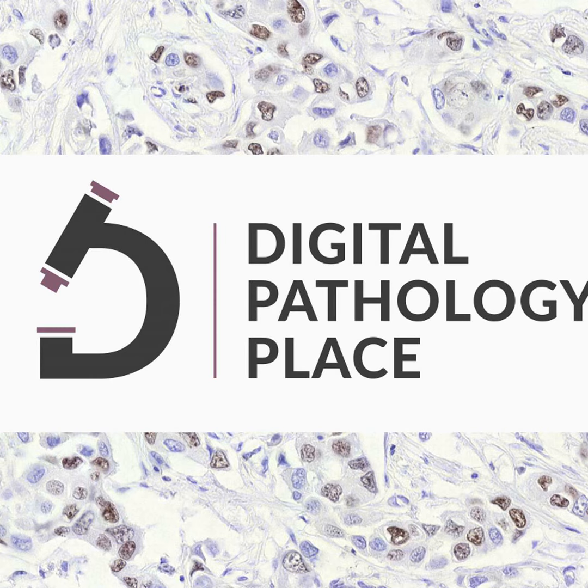The process involves several steps, including digitization, digitalization and digital transformation. In this chapter, we will take a deeper look at these concepts and how they have impacted digital pathology. Digitization currently involves making glass slides accessible in digital form by scanning them. And I say currently because maybe in the future we're going to get to glassless pathology and we will not have to make glass slides at all. But at the moment, it's scanning the glass slides. While digitalization involves using these digital slides for evaluation or other purposes, such as image analysis.